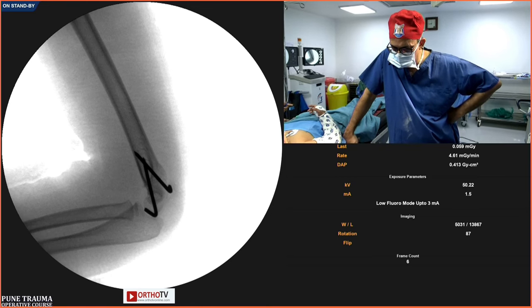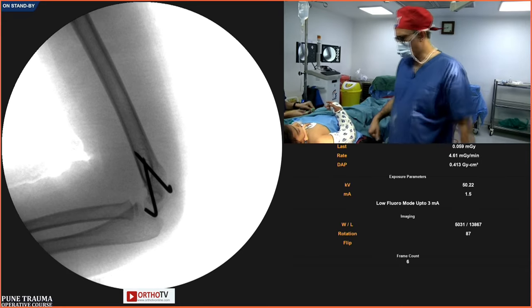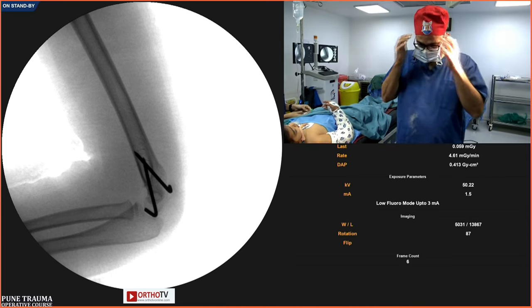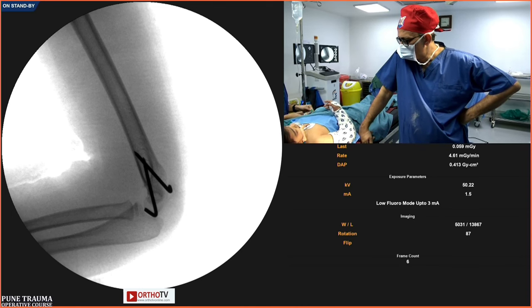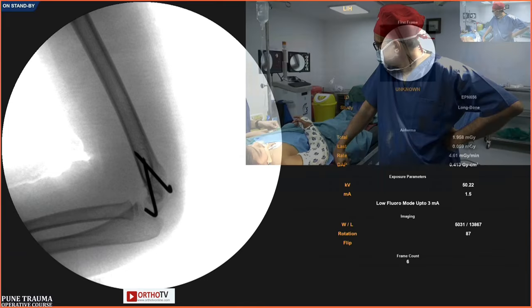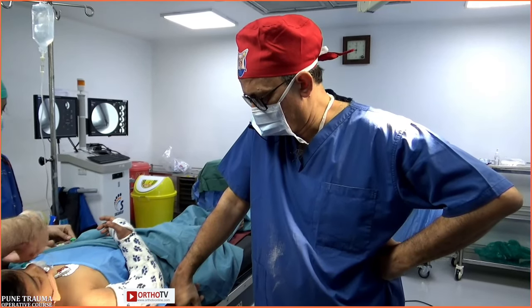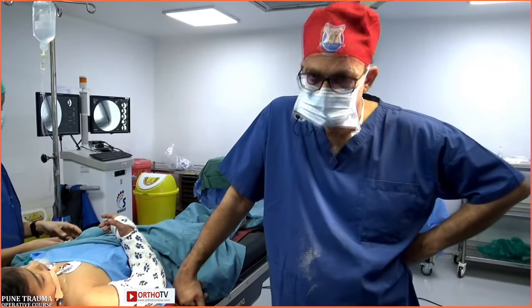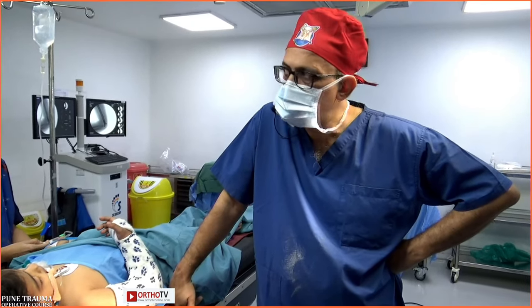Some of the ways of doing it is to pass a proximal humeral wire just above the fracture so that you have control over the proximal fragment. Typically, this K-wire which I pass is not a 6-inch wire, but a 9-inch or a 12-inch wire so that your hands can hold it well. My other wire goes to the distal fragment, which I use as a joystick. After confirming the reduction, you can advance the same joystick wire, or pass another wire with someone holding that position. So these are tricky situations, and they need special techniques.